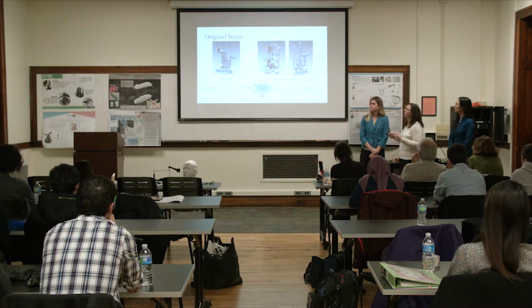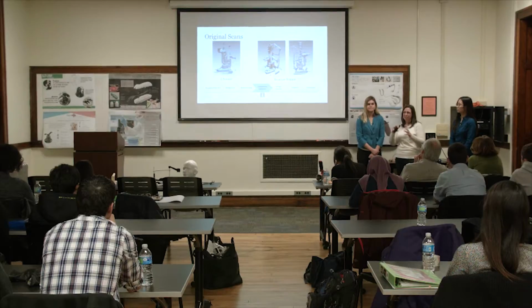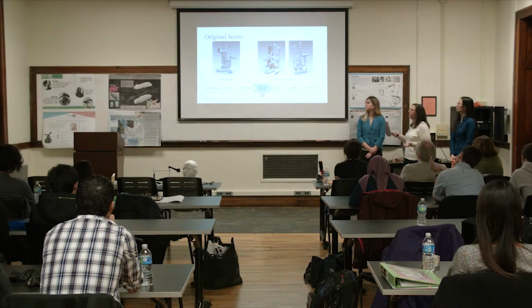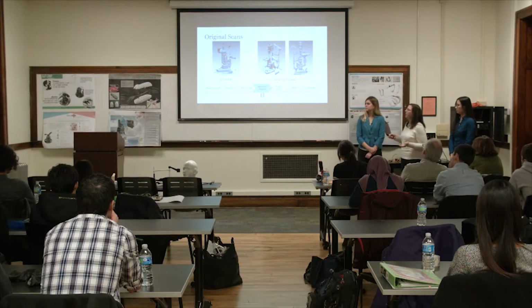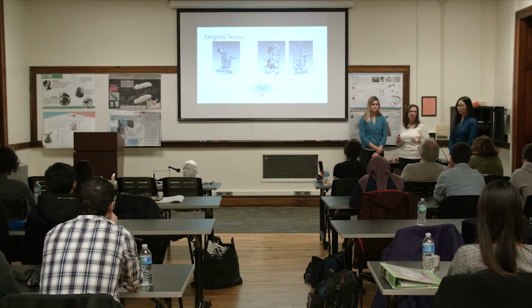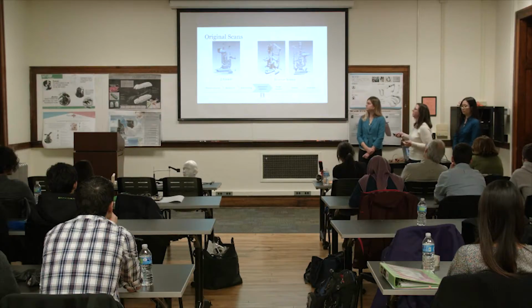Before we got going on that, we went to Dr. Sapersky's office, and we also went to Dr. Kessler's office and scanned their slit lamps so that we could have the working model, if we want to call it that, to base everything off when we were doing our CAD modeling. We used two different types of scanners and got really different results because of the material of the slit lamp. The Z scanner is the one that we have here in the engineering building. And the structure scanner is what we checked out from the art building, and it creates object files, but it takes images basically, so it doesn't give you the same quality of a mesh.